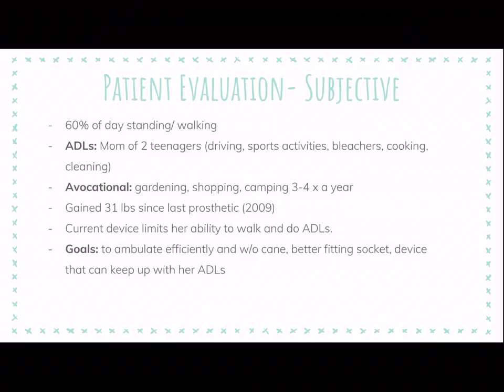The foot is also in a similar condition. It's not keeping up with all of her activities. As I mentioned before, she's pretty actively involved with her kids and with their sports events, etc., and it has a potential to malfunction due to the wear.